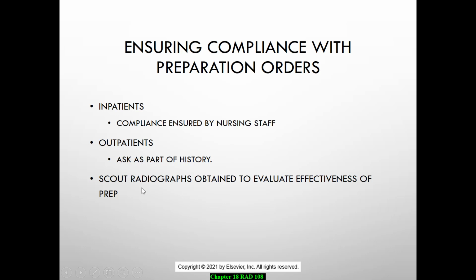Your scout radiographs are something that you need to do on every patient to make sure that they have been properly cleaned out and that there isn't any contrast media that's going to interfere with that study. So when you bring your patients back, you should make sure that you've asked, have you had any prior exams? If they say yes, you need to continue that conversation and find out what they've had done. Sometimes your inpatients, they're not going to know, and the nurse that's on duty might not know. So that's a way to take a look at the chart, find out what they've been ordered, and then determine, can we continue on with the study.